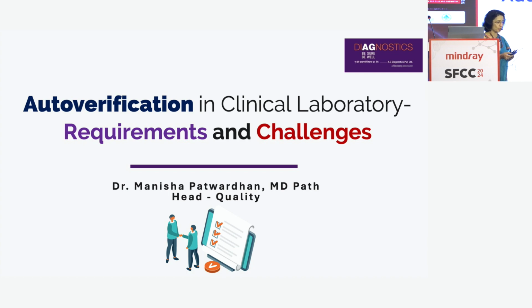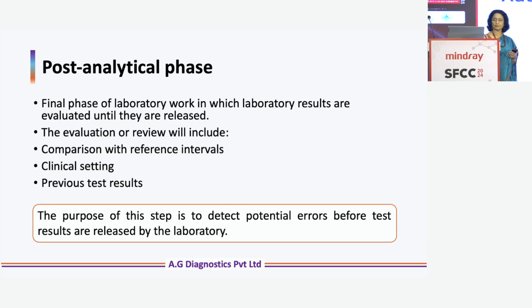So I took up this topic, auto verification in clinical laboratory: requirements and challenges. This is a part of the post-analytical phase, and if you all realize, the post-analytical phase is a phase we talk about very less. Usually we concentrate on the pre-analytical and the analytical phase, and the post-analytical phase is like the stepchild.